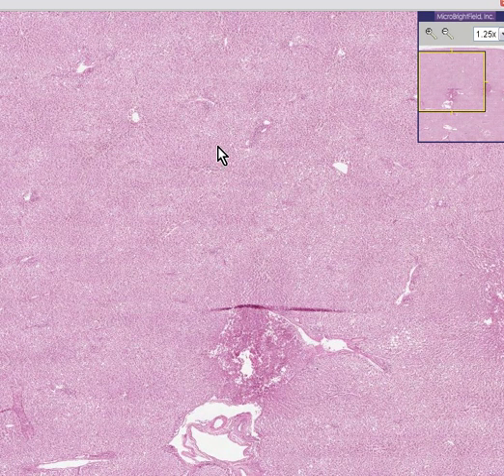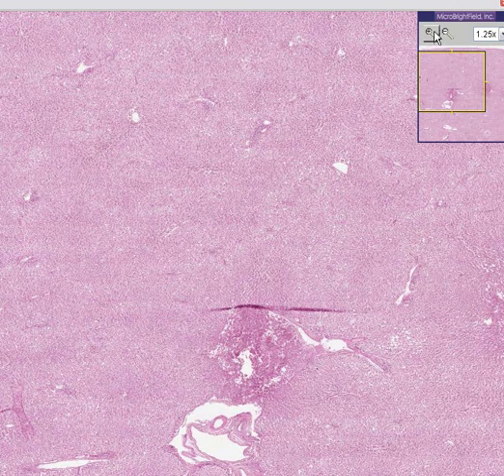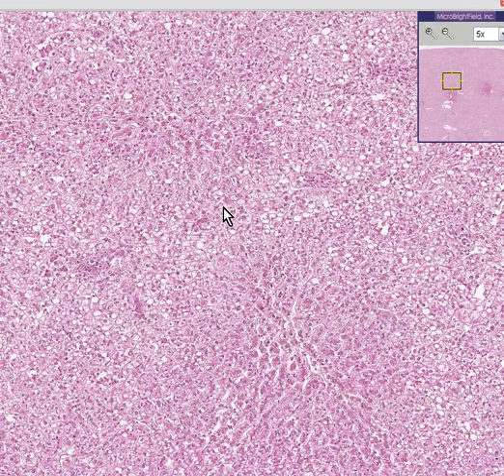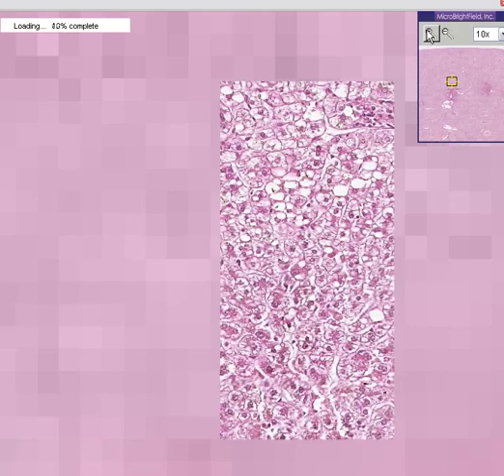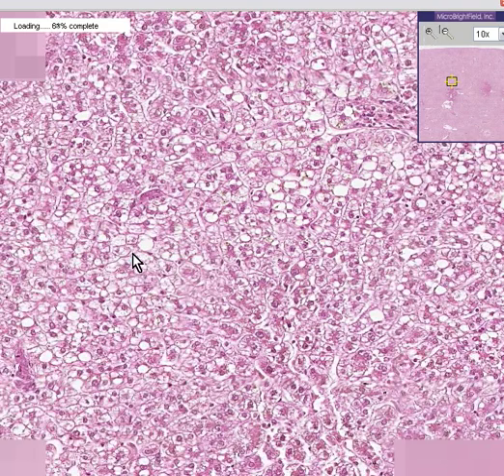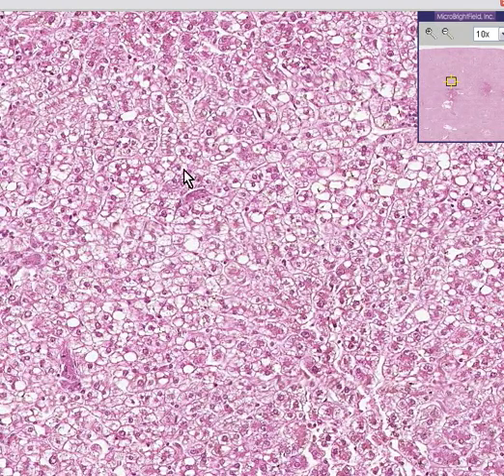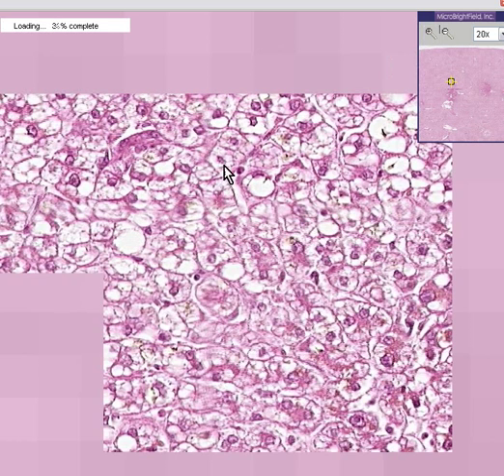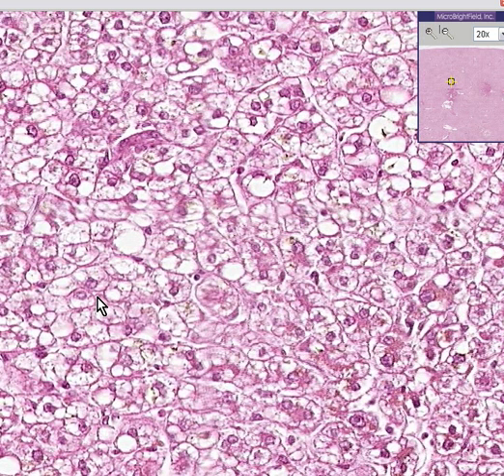Is that because the technician forgot to put in enough eosin into the stainer? Or is it because a large portion of the cells are vacuolated? I think B is the correct answer because, look, here are hepatocytes, and notice that within the cytoplasm of the hepatocytes there are these small cleared spaces which represent fat. This is a fatty liver.